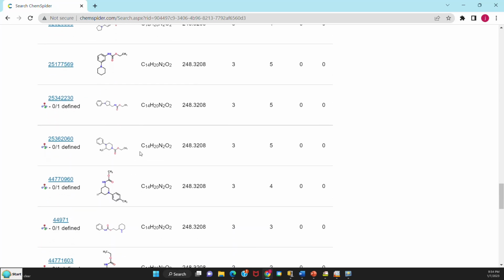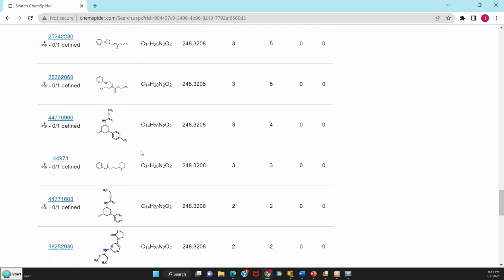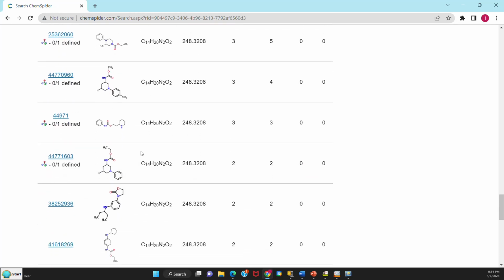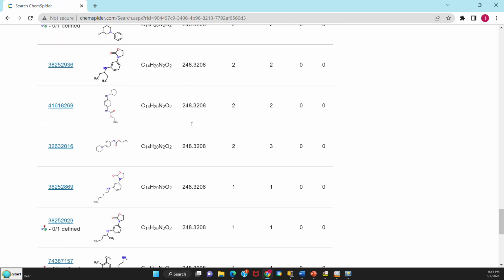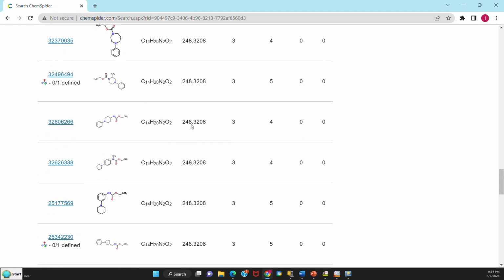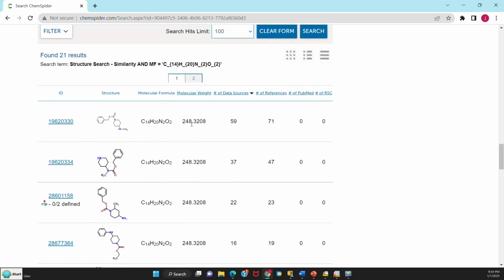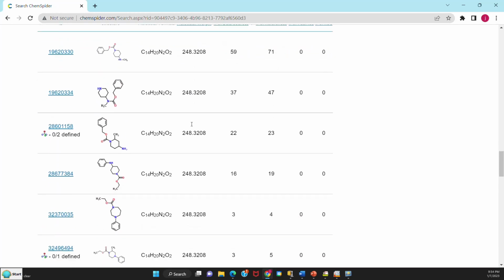So if it hadn't matched the known compound of known structure, then we'd have to consider some of these other possibilities by either NMR or finding out if there's a reference spectra or other information to narrow it down to the exact structure. So I think in this case, the Tanimoto was useful just to make sure that if there were other possibilities that we hadn't considered, we would have some other options of proposed structures.